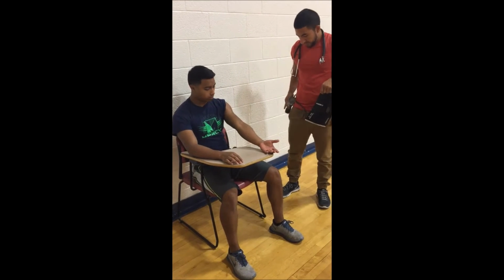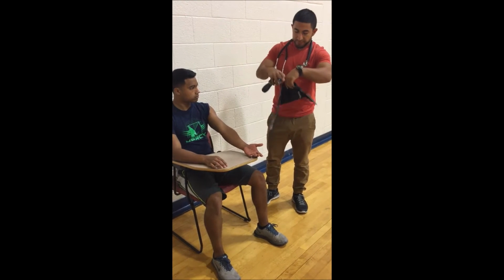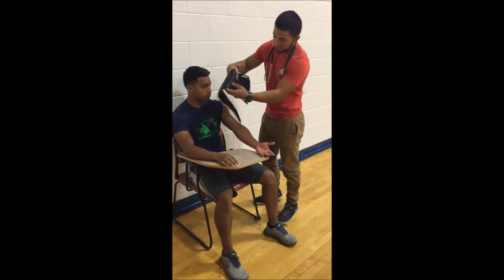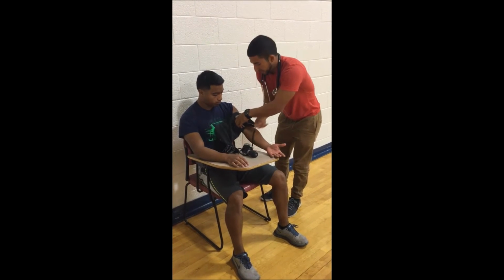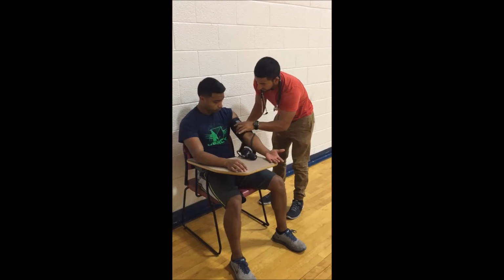The appropriate cuff size must be used to ensure accurate measurement. The bladder within the cuff should encircle at least 80% of the upper arm. Align the cuff with the brachial artery. Make sure the cuff is wrapped firmly around the upper arm at heart level.